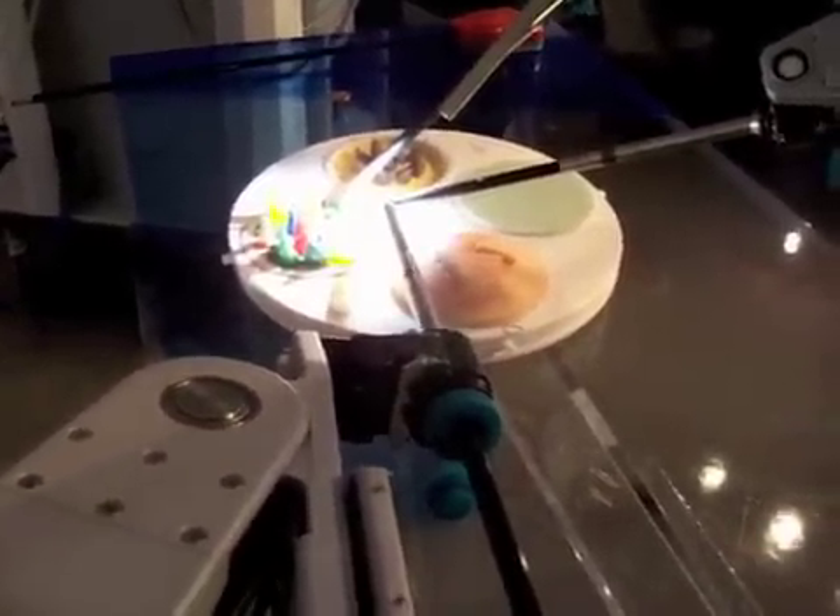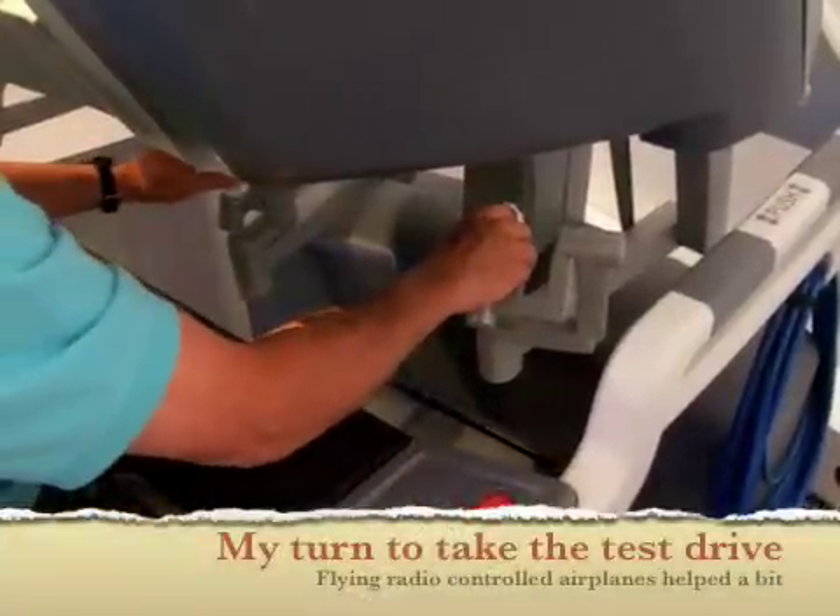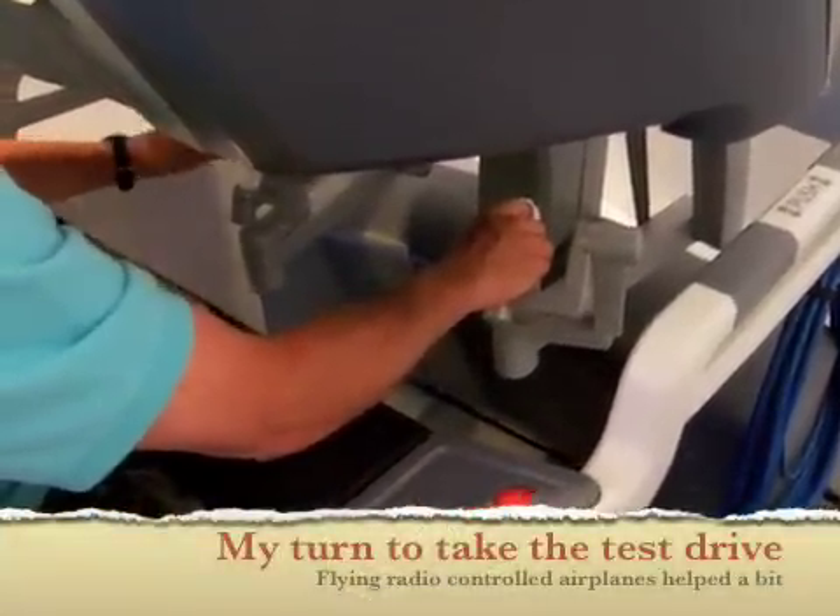And the system is actually intelligent — it knows if you're trying to cheat. All right, here we go. This should be like flying airplanes.